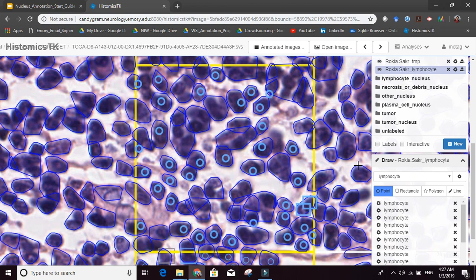Now, let's find lymphocytes where the algorithm didn't really get the boundary correct. So now let's put all the rectangles. So you can see there's a lymphocyte here, there's a lymphocyte here where the boundary is just completely wrong. There's a lymphocyte here, there's a lymphocyte here. So what you want to do is grasp the full extent of the cell of interest, right? You also don't want to be too large though, so you want to be exactly at the boundary or exactly at the size of the cell.